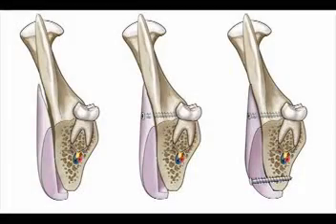The diagram shows that, on the left, the posterior surface of the implant is not congruent with the anterior surface of the mandible. The superior screw obliterates the gap and makes the implant reflect the contour of the mandible in this area. The second screw obliterates all gaps. Now the implant reflects the contour of the mandible. The increase in the augmentation is only that of the implant.